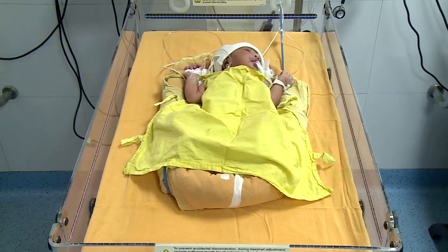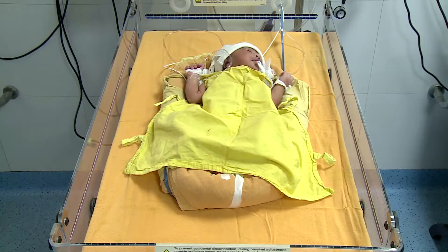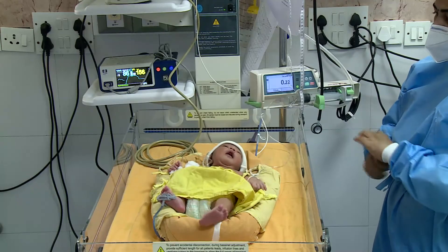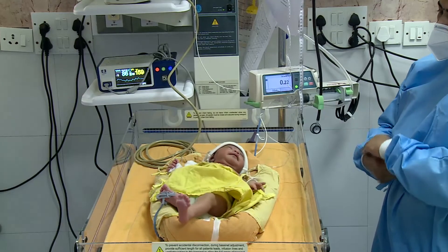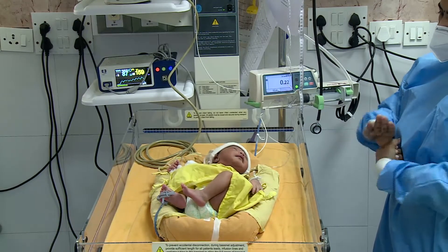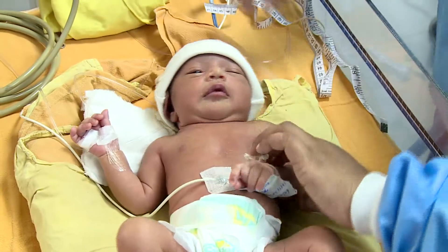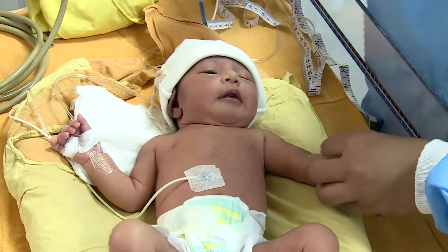Blood pressure is monitored for all neonates who are at any risk of hypo or hypertension. Monitoring helps in detection of hemodynamic instability. Observe hand hygiene before measuring the non-invasive blood pressure. Place the infant in supine position with limb extended.